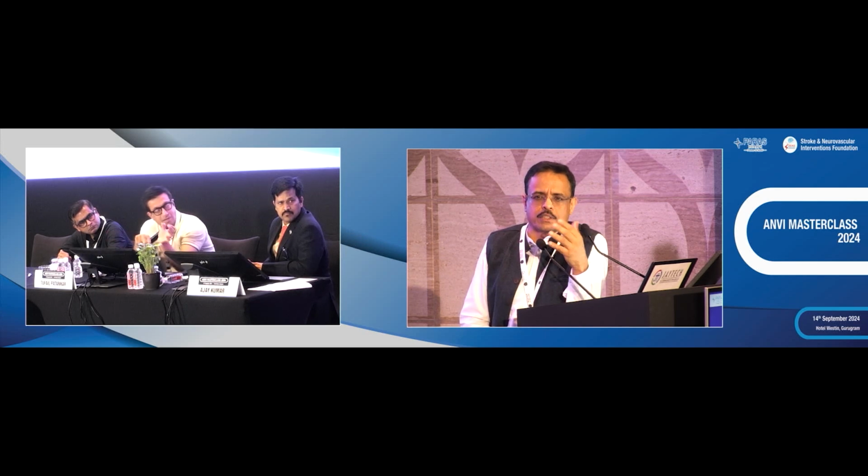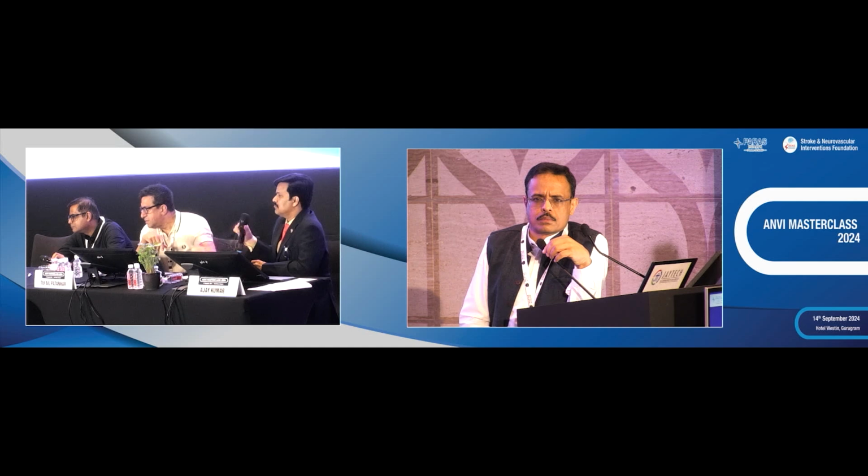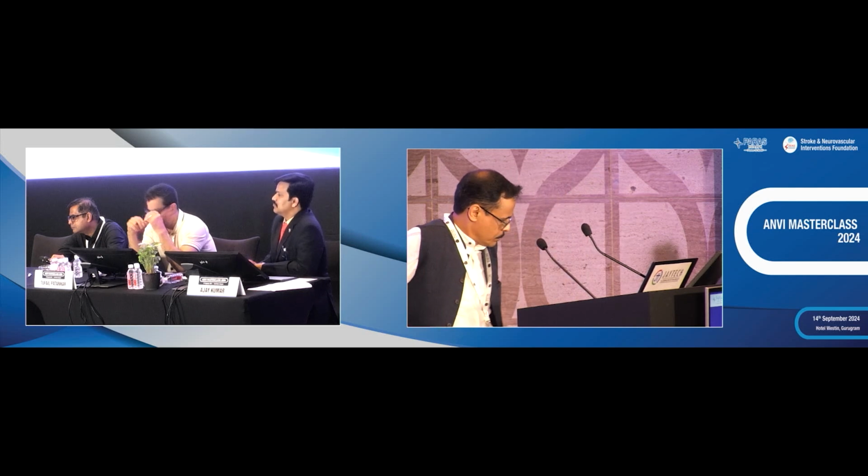Maybe Vincent can say whether he had a rupture. No, I think it's uncommon in ICAD when you are in the true lumen to have a rupture. I don't remember a rupture. We had ruptures in different situations, but not in this one.